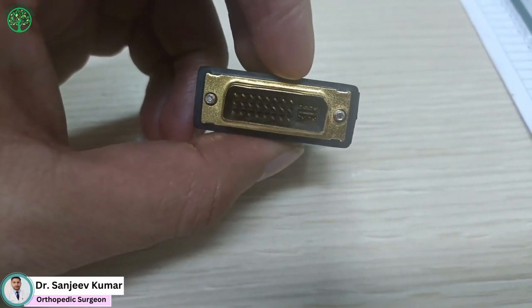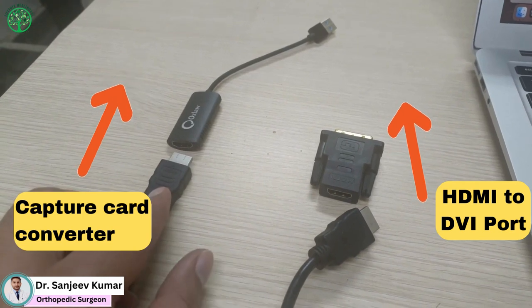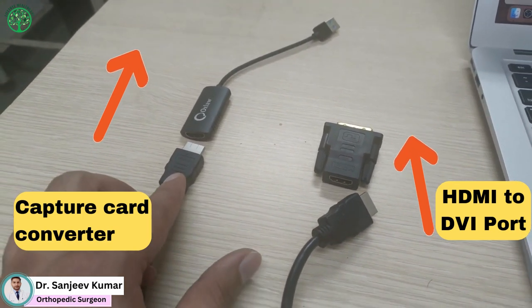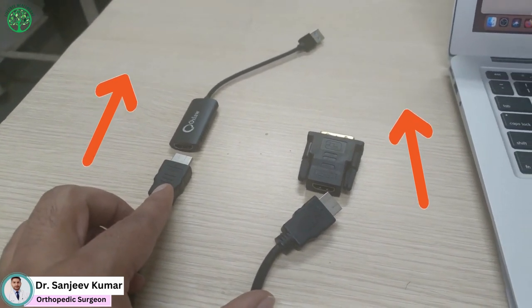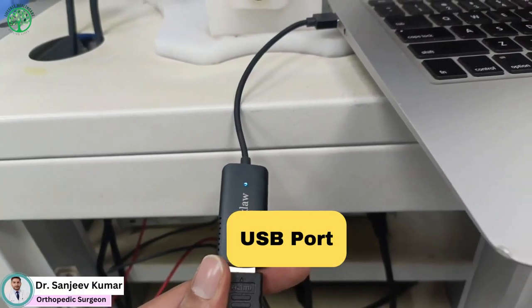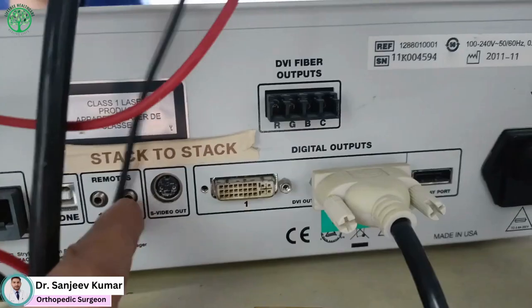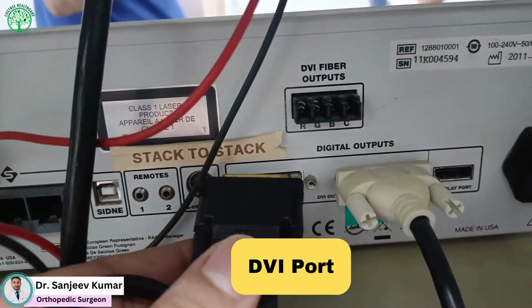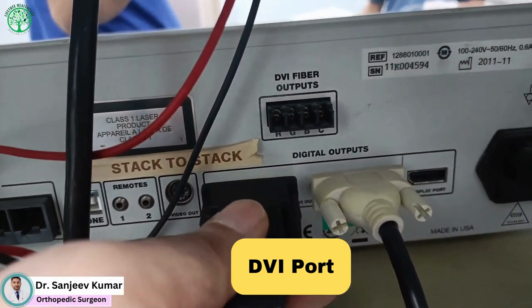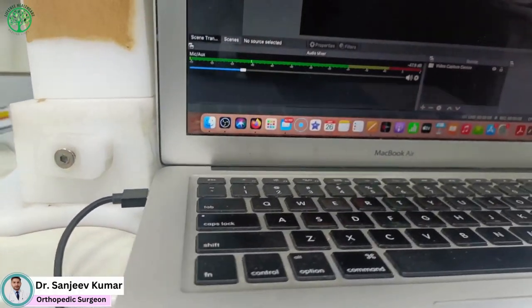Talking about connections, you need to connect the capture card to one end of the HDMI cable and the DVI converter to the other end. The capture card will be inserted into the USB jack of your laptop. The DVI plug needs to be inserted into the DVI jack on the back of the camera.